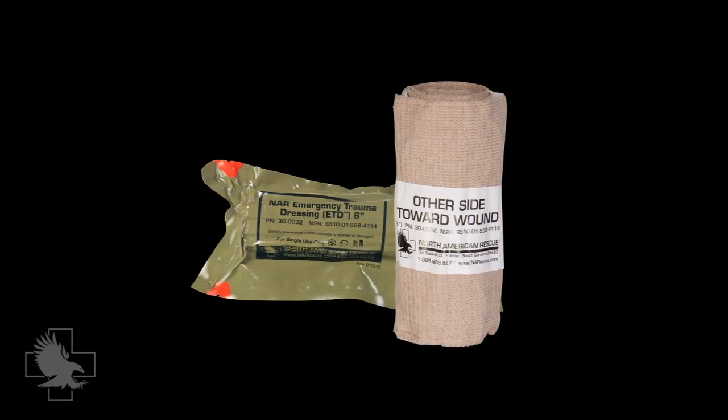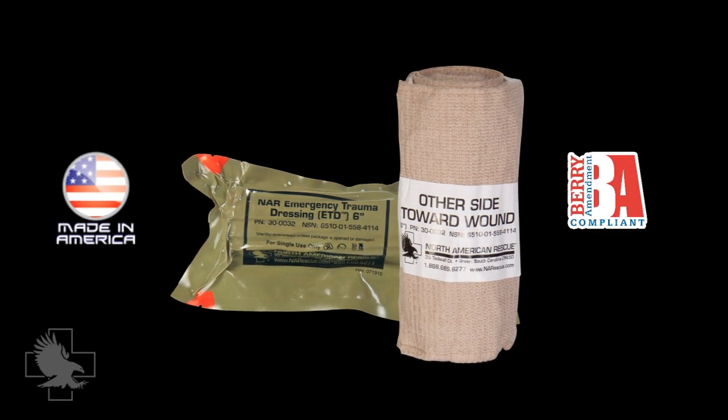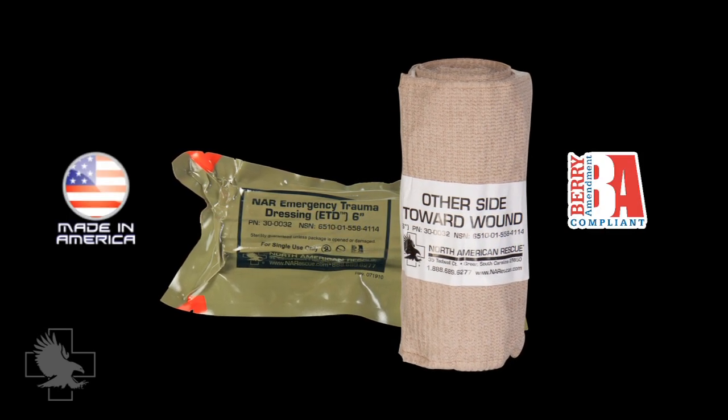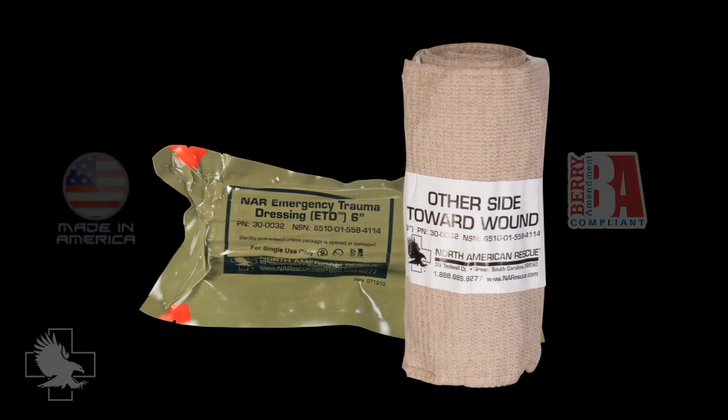The North American Rescue Emergency Trauma Dressing, or ETD, is Berry Amendment compliant and made in America with domestic cotton products. It is sterile and latex-free, and is packaged in a ruggedized, vacuum-sealed pouch with NARS Signature Red Tip Technology Packaging.